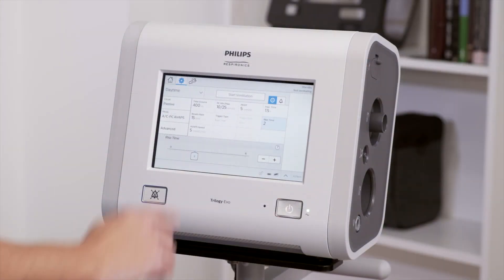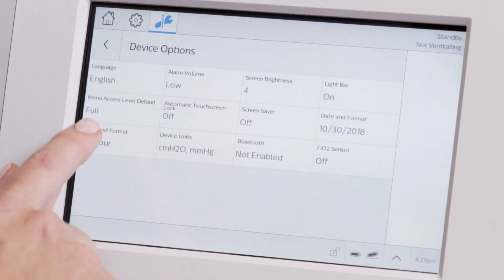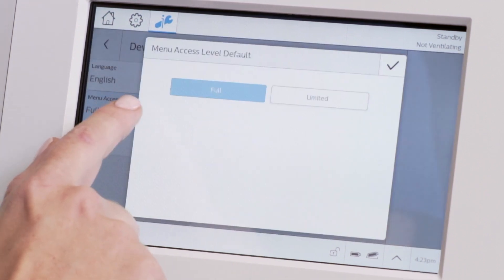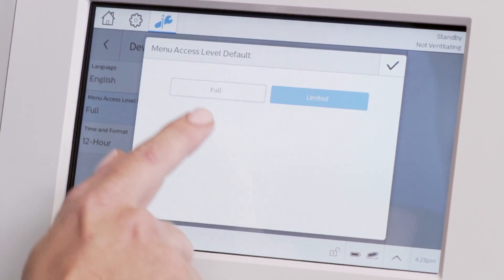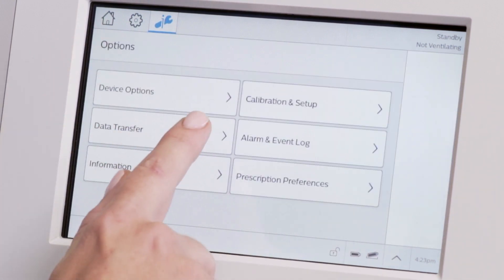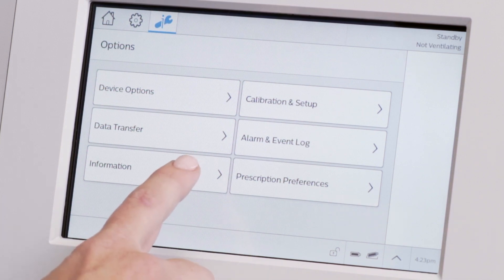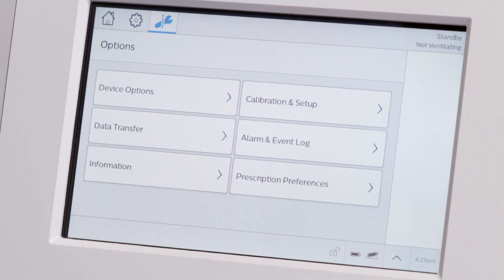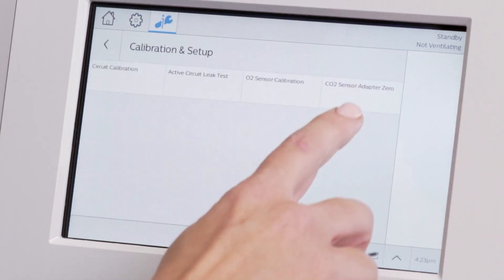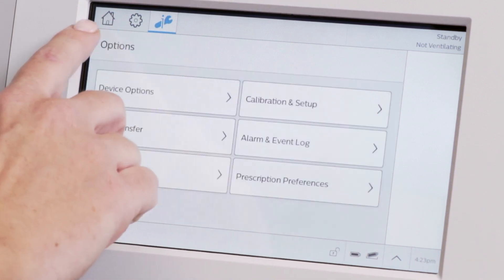Options, which contains preferences and other choices, is next. You can change the menu access level between Full and Limited. Use Data Transfer for USB data downloads and software upgrades. Information provides device details such as current software.